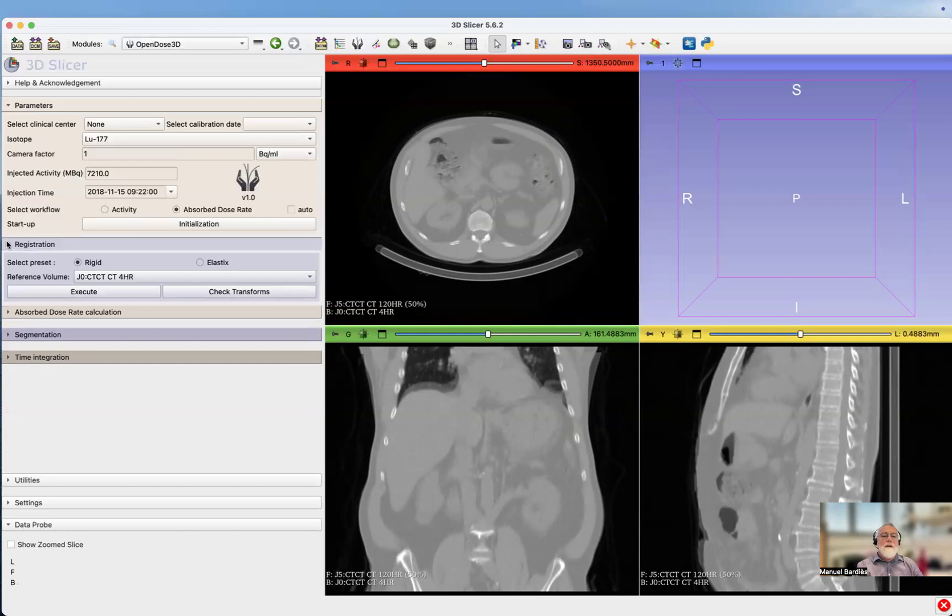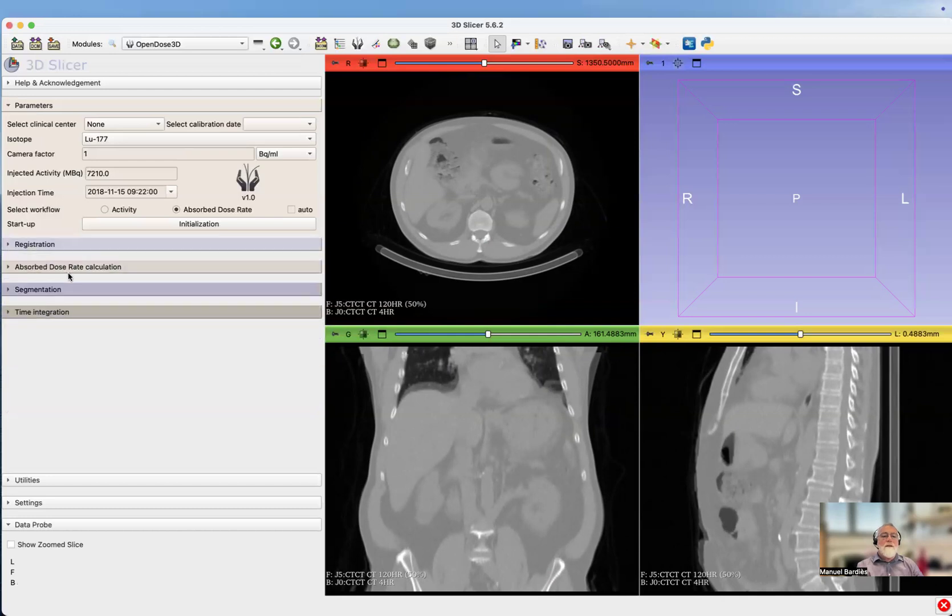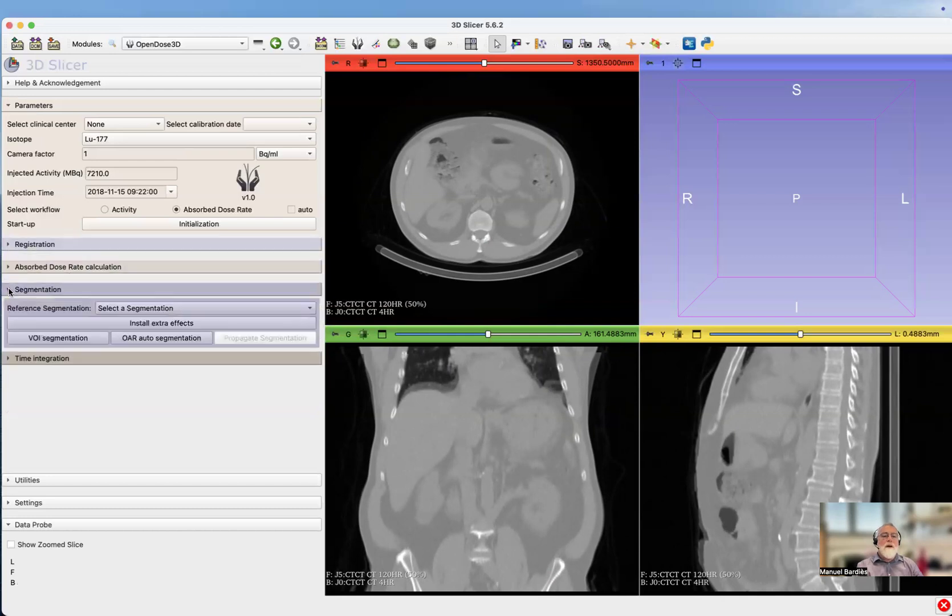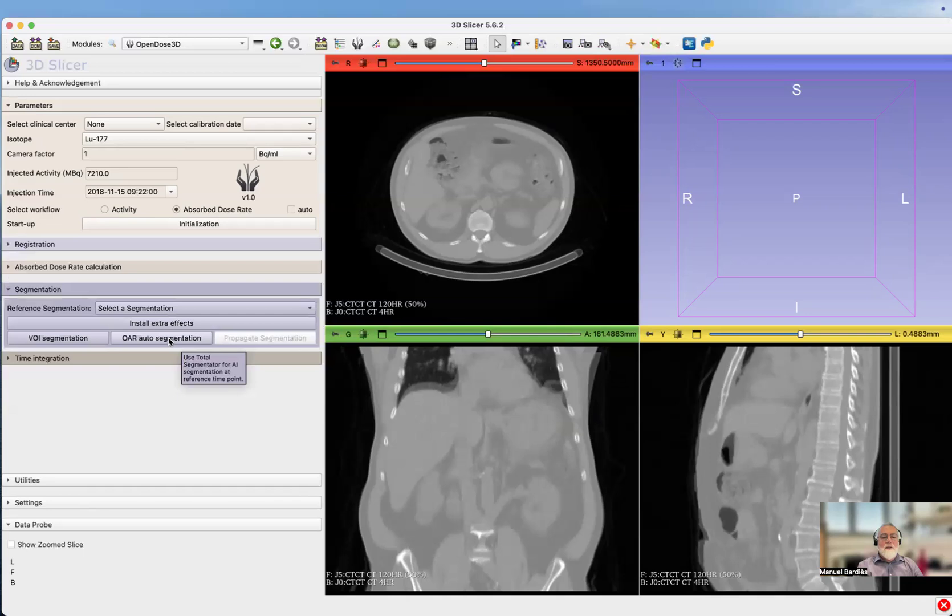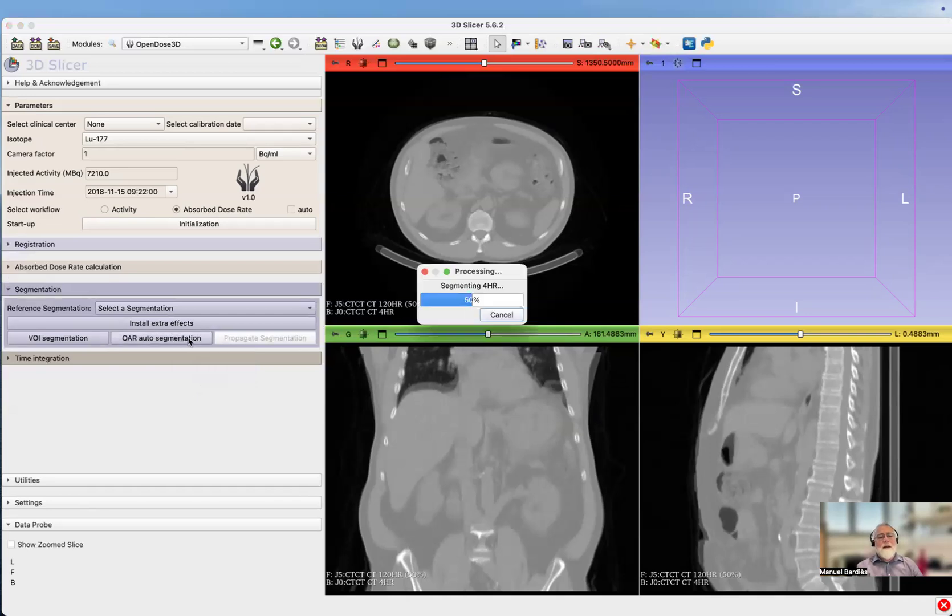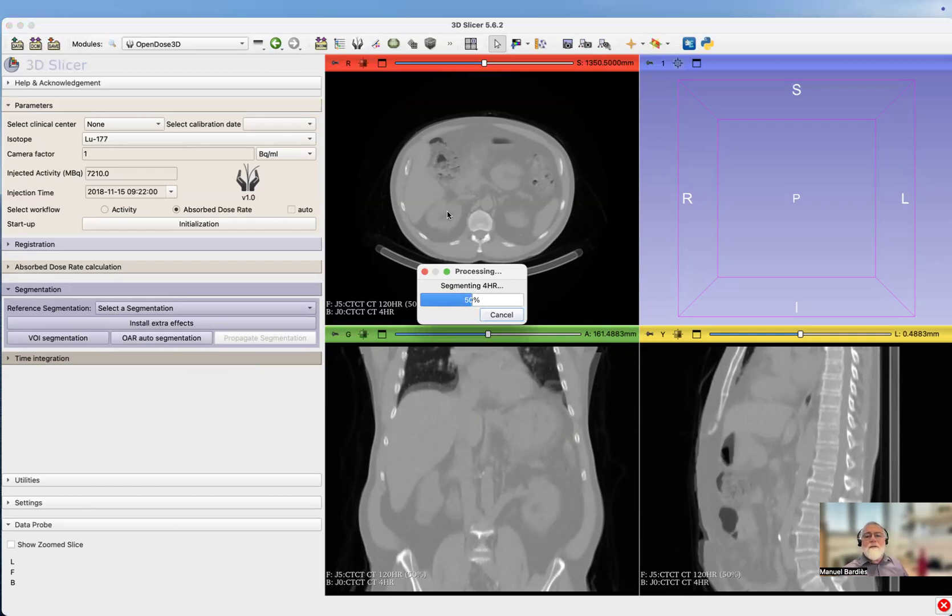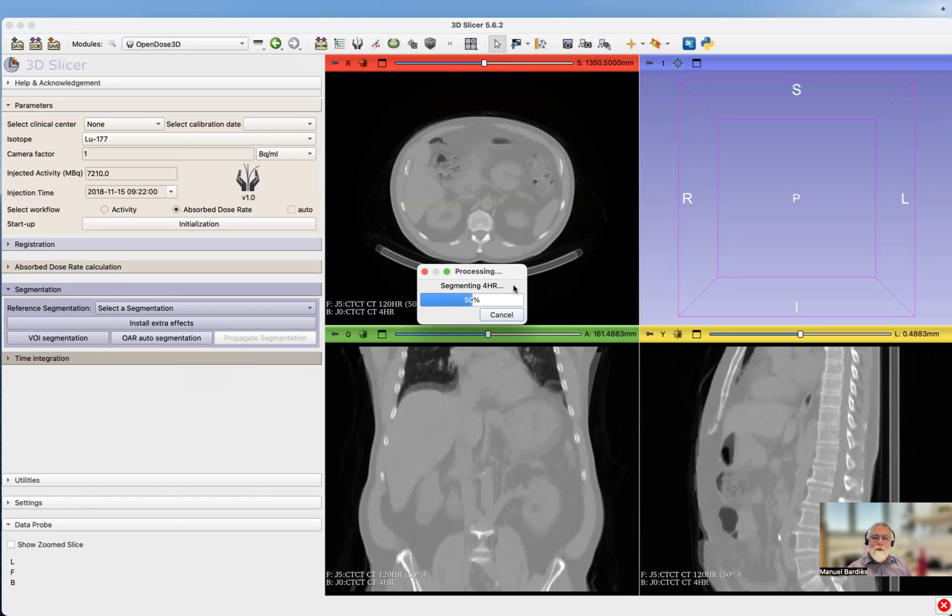We have registered images. Now we need to do the segmentation. We are going to do an automatic segmentation. This means that the software is going to launch Total Segmentator and it's going to segment on the reference image at four hours. It's going to segment predefined volumes.